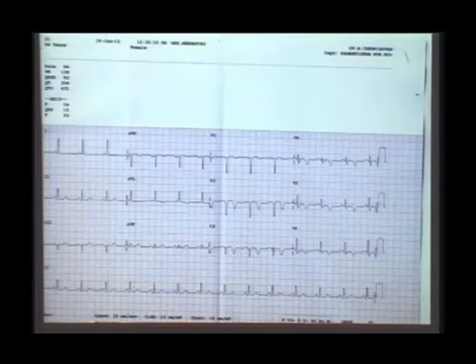Then you must go into the causes of why the injury is not getting cured. Whether it is ongoing ischemia, significant LV dysfunction and aneurysm, or pericarditis. If the patient has pericarditis, ST will not settle down. So you must go into the causes of why there is a persistent ST elevation even after the time where it is expected to settle. That's why the evolutionary changes are important: you must see why it is not happening and treat the appropriate cause.